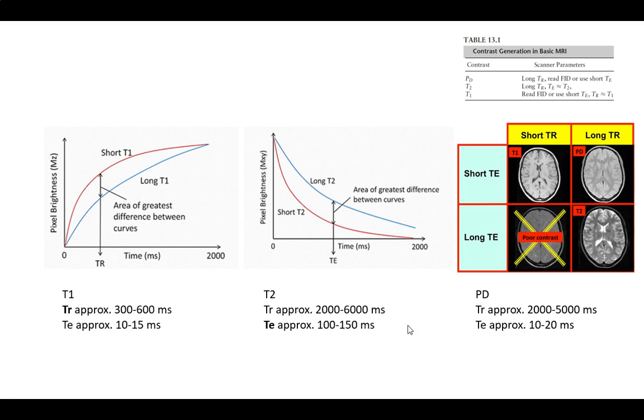This has to be way bigger so it doesn't interfere, so we set it out 2 to 6 seconds between them. That's long enough that any effects have died and are isolated. Does that make sense? All right.